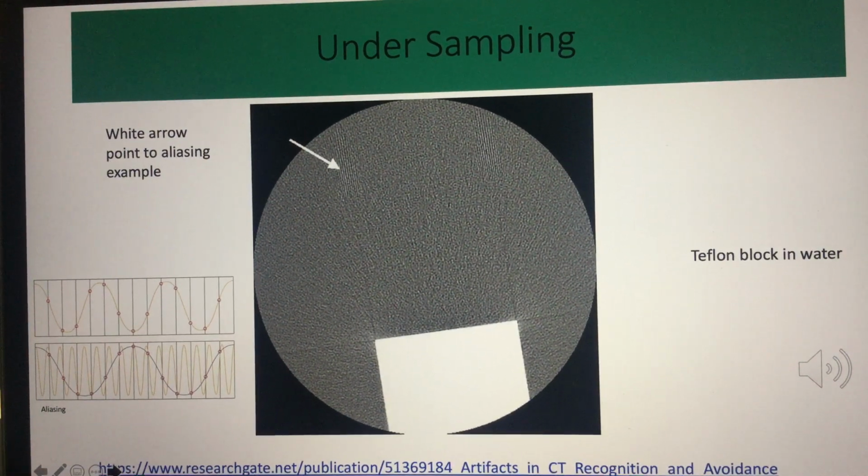Undersampling on a CT image is one of the factors in image quality. The interval between projections can result in misrepresentation by the computer. The information that is sent to the computer, the signal, is not strong enough, so they copy the real object incomplete or not as sharp as it should be. The edges and small objects are not visualized.